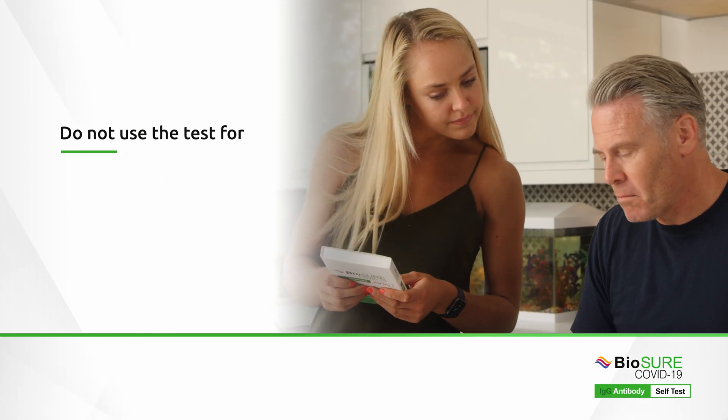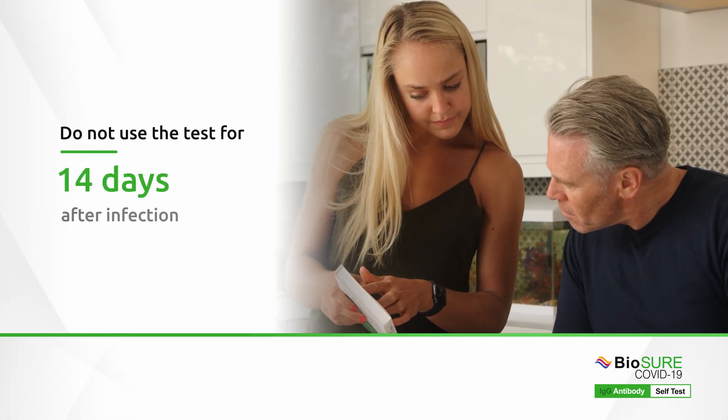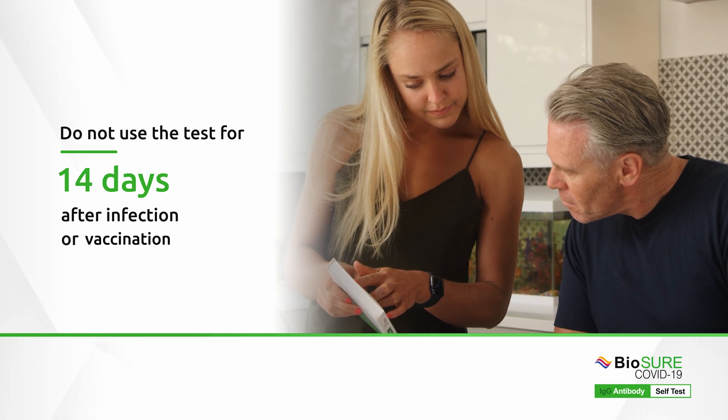We recommend not to use this test until at least 14 days after infection or your second vaccination.